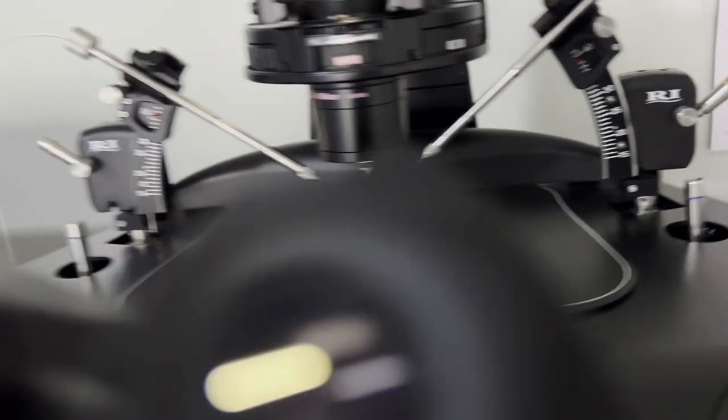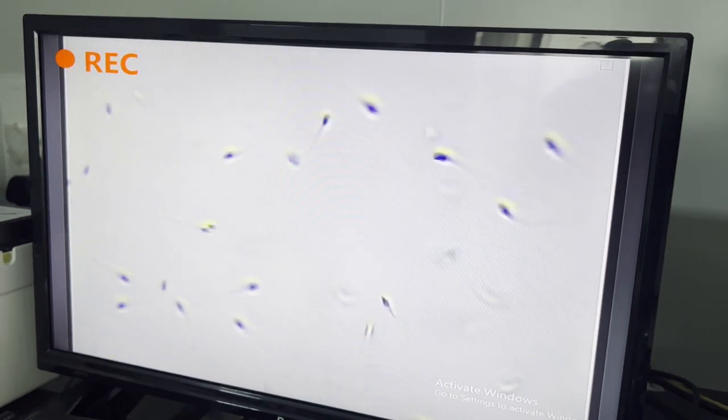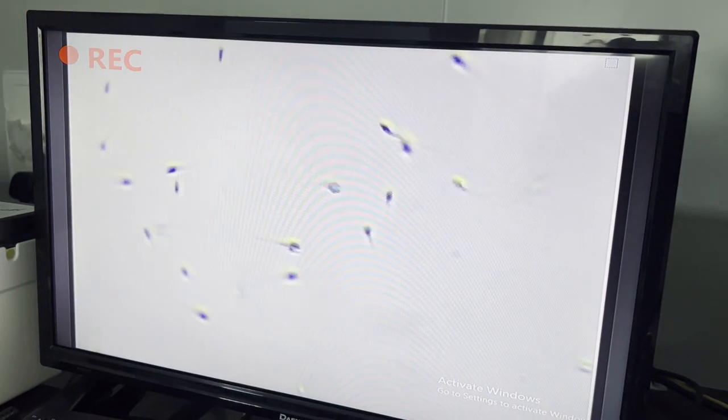I have loaded this semen sample in our ICSI dish. So this is the result — you can see 100% motility we got here by using this device. Morphology is not as good, but yes, motility is excellent.